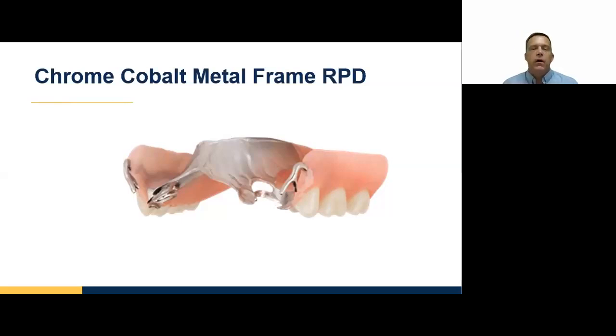It gives you tooth support, so you can minimize the force on the saddles. You can do creative things with it. Let's say a person has 2 or 3 teeth left and you want to open the bite. You can make a partial with metal occlusals on those teeth to open the bite. So they really give you a lot of different options.